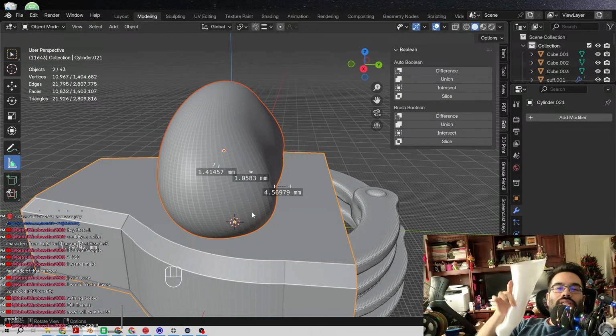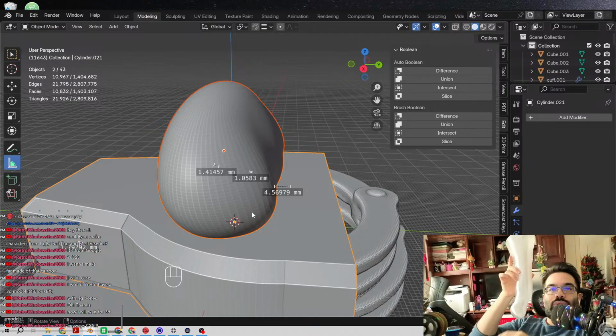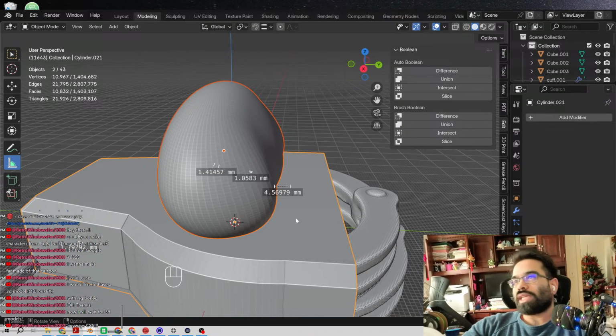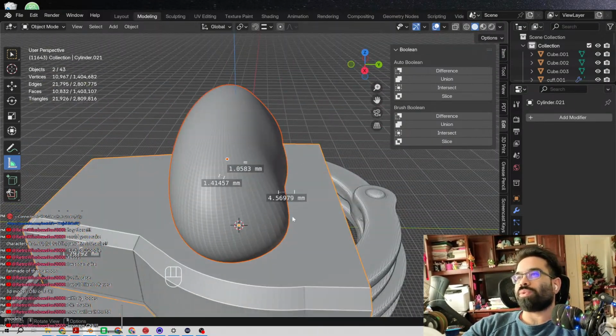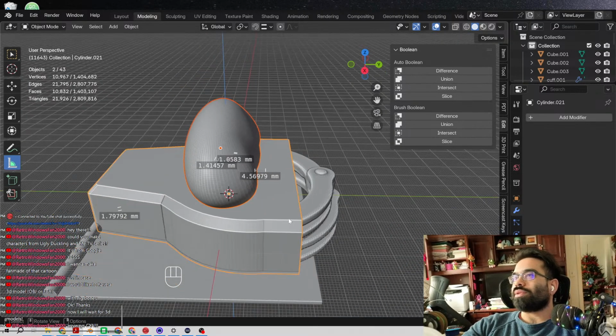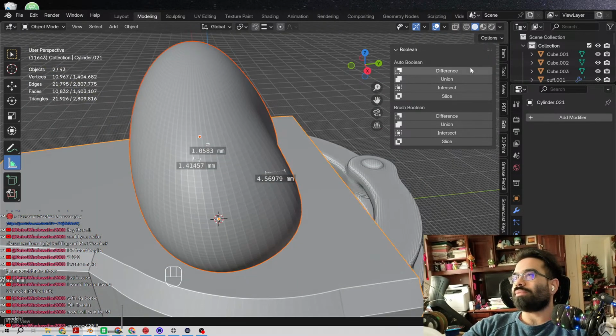This is actually a test socket, so this goes over the person's residual limb, right? And then they'll glue a foot to the bottom so the person can walk around. Really, that's my forte, is to work in the real world, you know? People who got amputated, or people who are born with missing a limb or something.